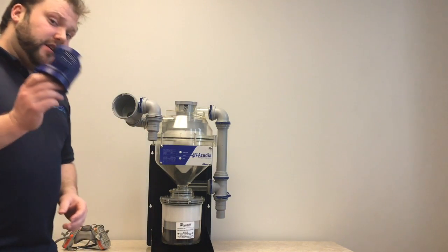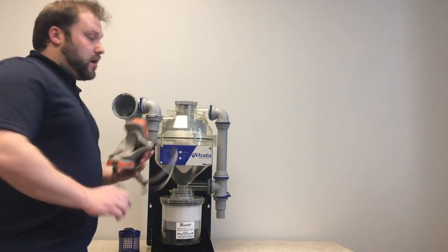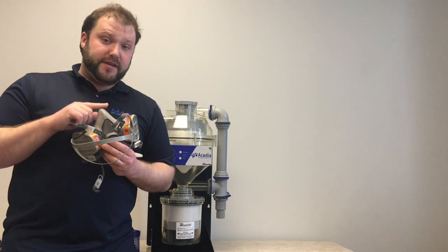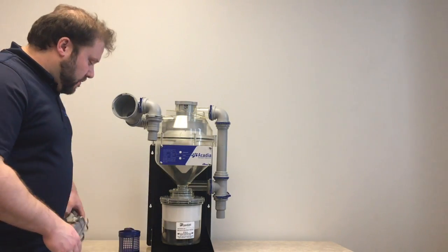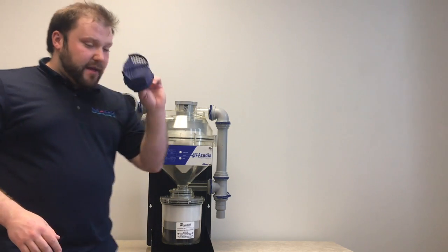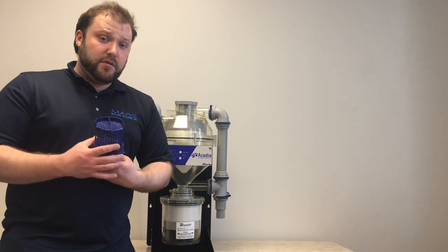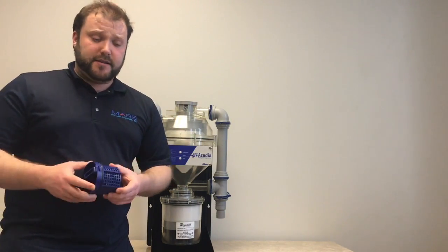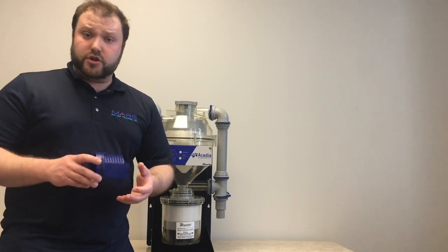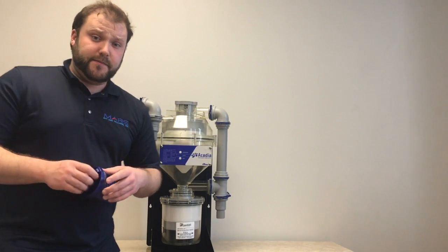So when you are actually cleaning out this trap, you should be wearing a respirator rated for mercurous gases and some gloves. And when you empty this trap, this cannot go in the garbage. This will have to go into a bucket that's sent off with the rest of your toxic waste. The same company who does your sharps and bio waste disposal should be able to handle this toxic waste.